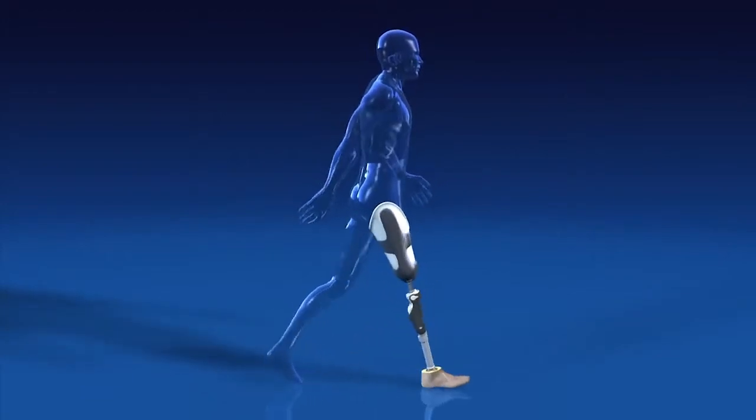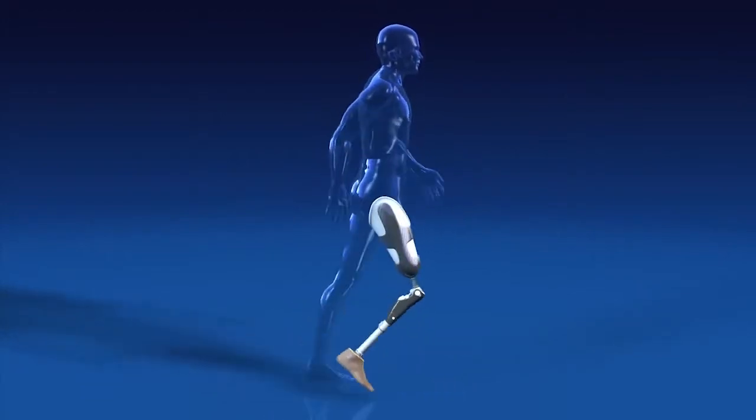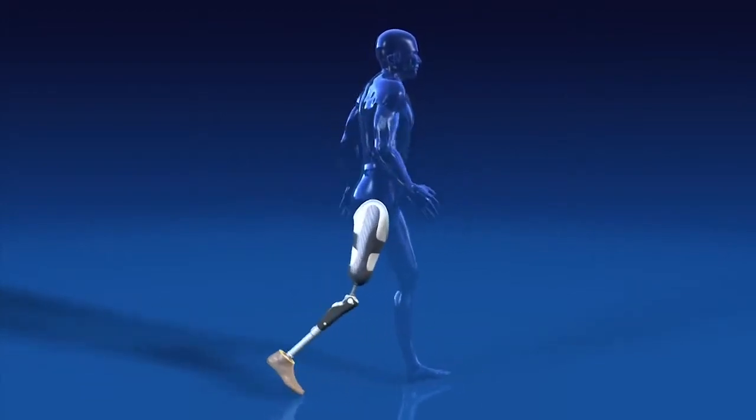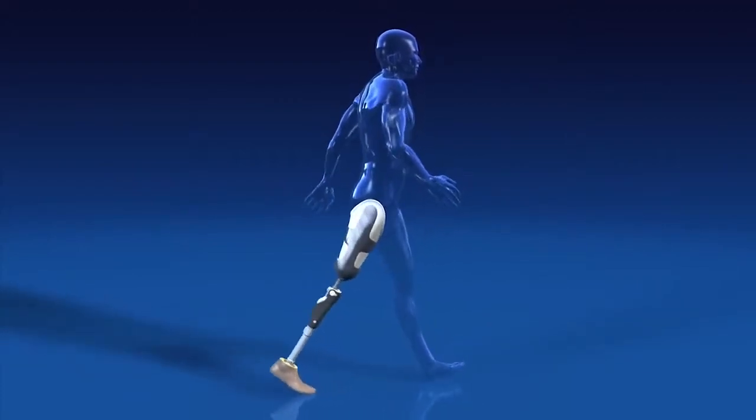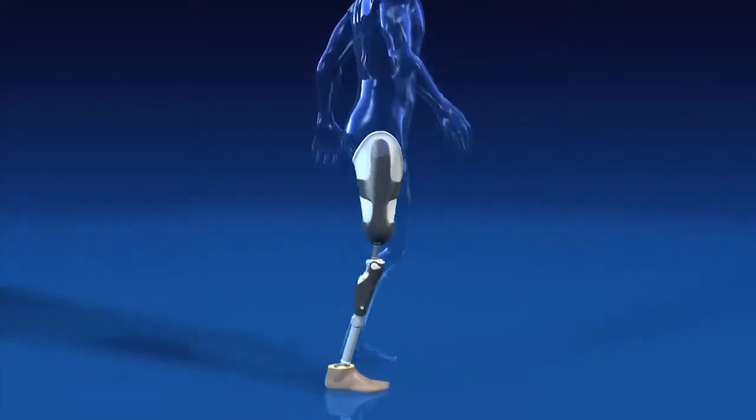Many of these important structures are missing after an amputation. The Sea Leg was designed with the objective of approximating the human gait as closely as possible. But how exactly does walking with the Sea Leg work?